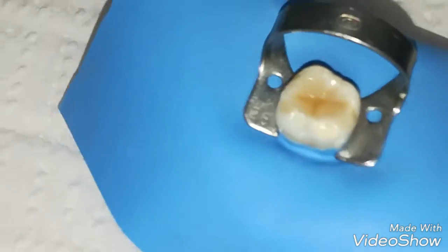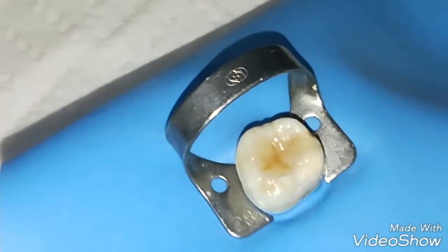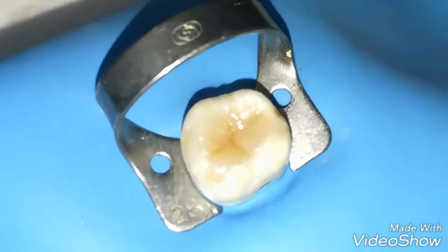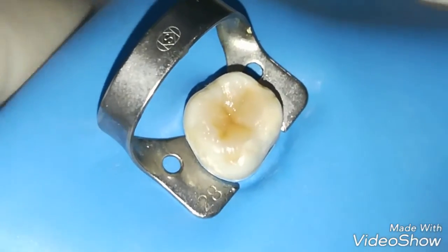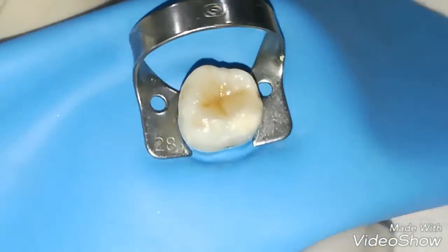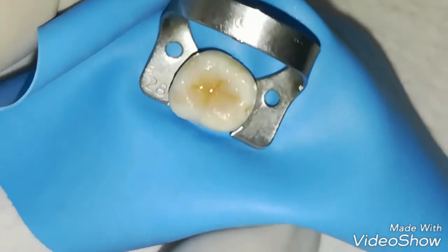Now we can see the completion of the restoration done with the injection molding technique with heated composite. We can see the literal difference — the perfect glazing of the restoration at each and every pit and fissure. We cannot see any kind of demarcation or white line anywhere — it is a perfectly glazed and balanced restoration.